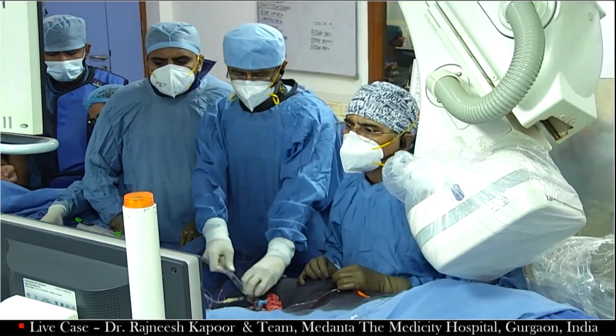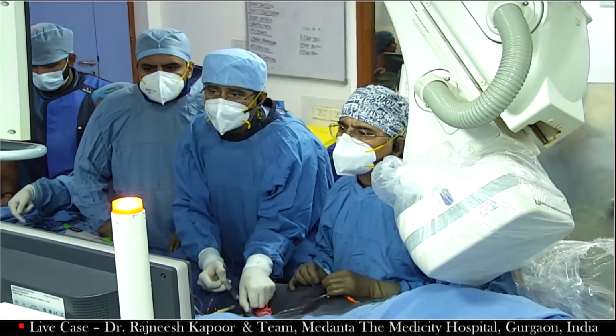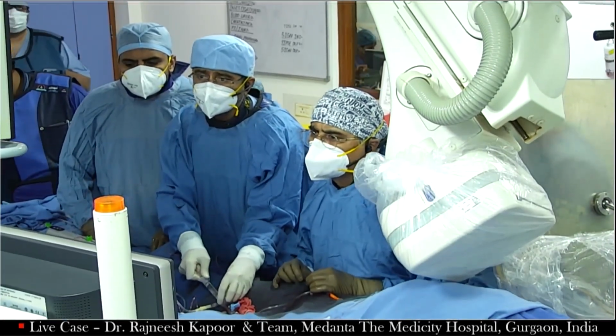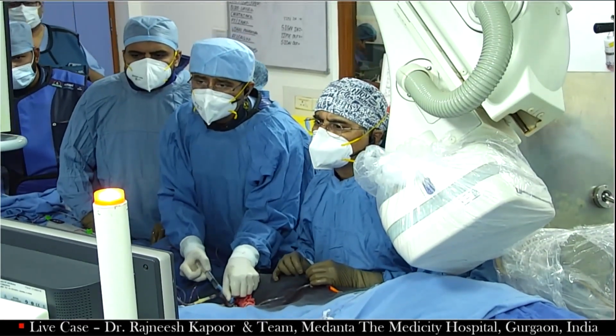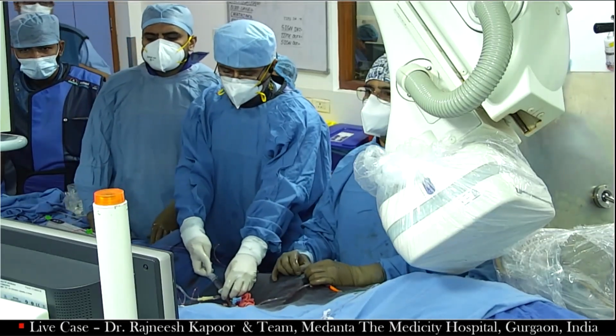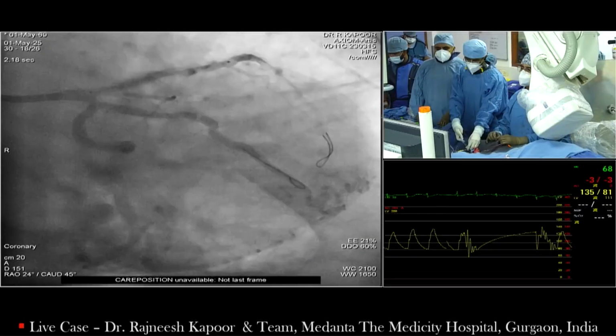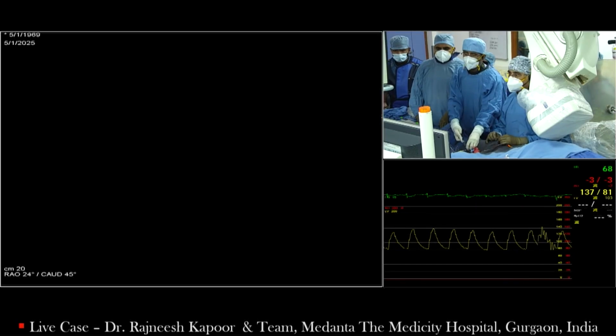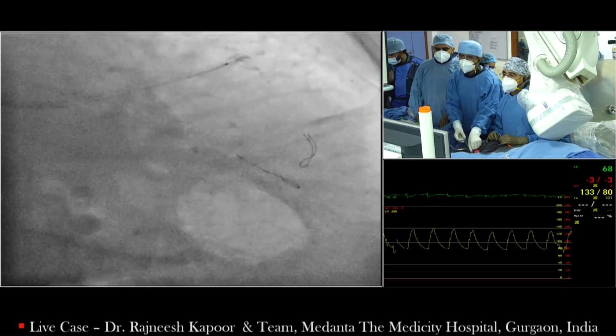Okay. And we have the images of the angio. Can you please show us the angio screen? Please show the angio. Yeah, screen live. Okay, yeah. We can see it.